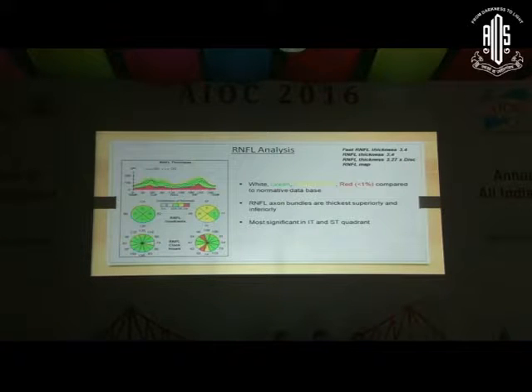Now, glaucoma affects 3 areas in the posterior segment of the eye, which are the optic disc cupping, the retinal nerve fiber thinning, and the ganglion cell loss. The RNFL analysis is something we are all familiar with, the most common parameter used to follow up our glaucoma patients. It is seen as a double hump pattern, and the distribution is given in the quadrantic map as well as a sectoral map. There are various scans that you can use, but remember to use the same scan in your follow-up.